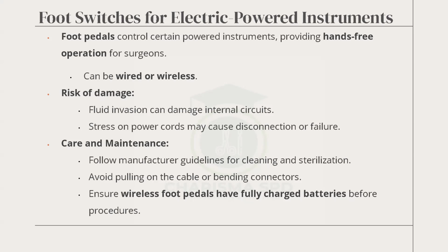They have to disconnect it. So they do the pulling. They do the connection, so they take it out. So the pulling happens over there. So they also get education. When powered instruments come in, they also do the in-service. They are trained how to connect it, how to disconnect it, how to carry it to decontaminate, all of that. So this part goes to the OR, all right? And the OR will always come say that it wasn't me.